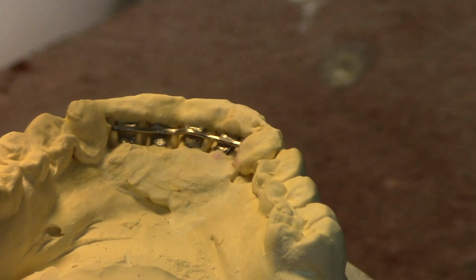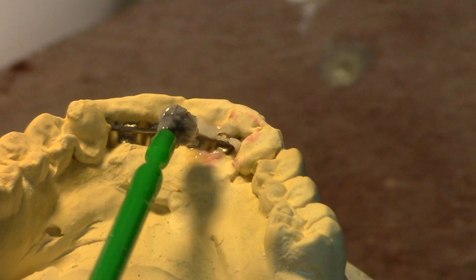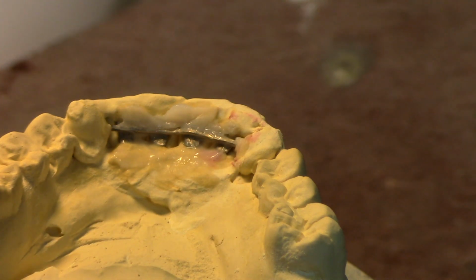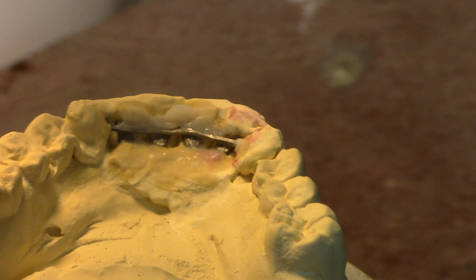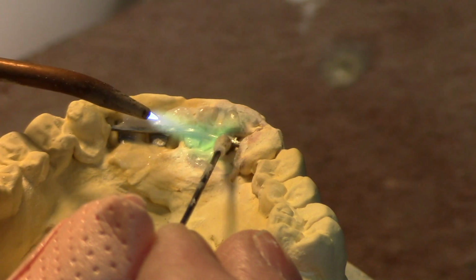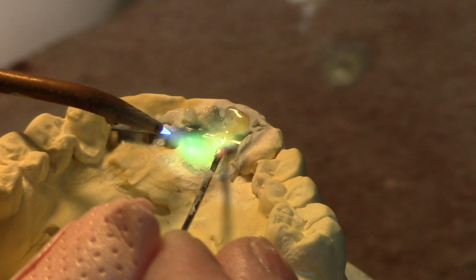Let me turn around where you can see it. I'm going to go ahead and put flux. I'm going to get a brush. I'm going to go ahead and put flux on all of them, because if the adjacent ones are going to get hot as well, I'm just going to spread a bunch of flux out here. This is just going to protect them, because if they get hot without any flux on it, they're liable to get some carbon on it, and that ain't going to be really good for soldering. So here we go.